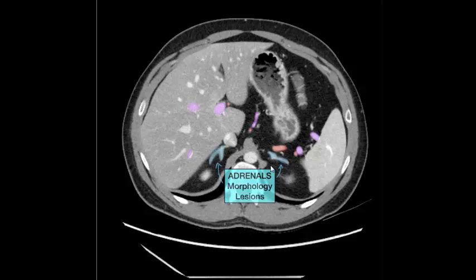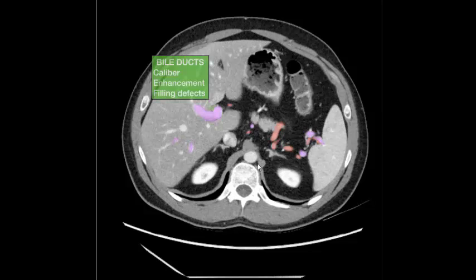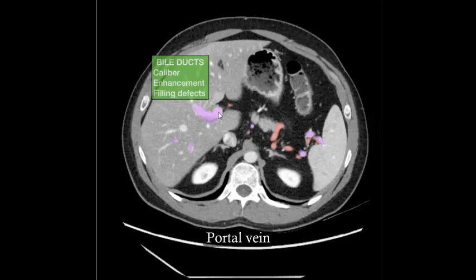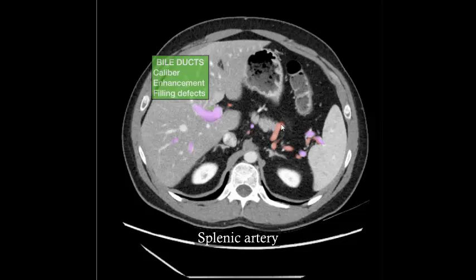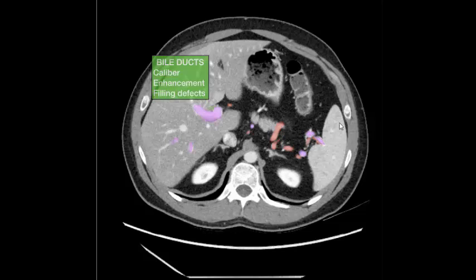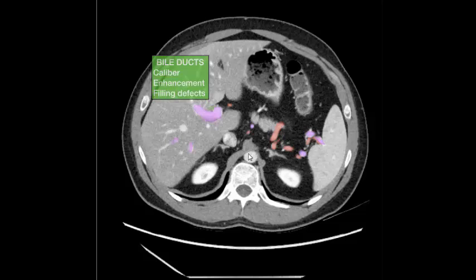Spleen, inferior vena cava, right and left kidney, splenic artery, spleen, transverse colon, abdominal aorta.